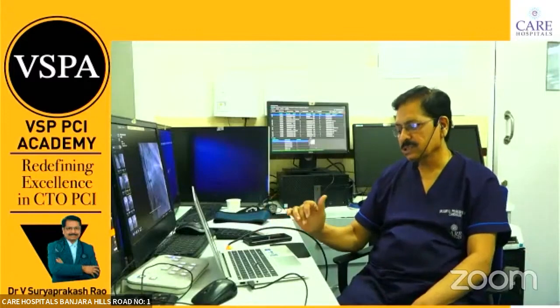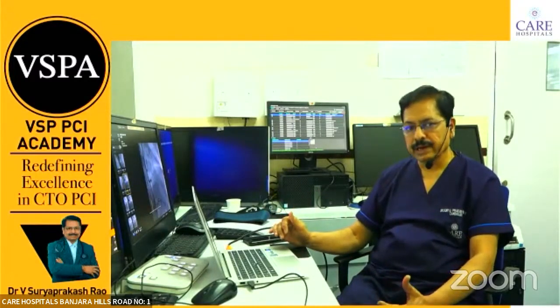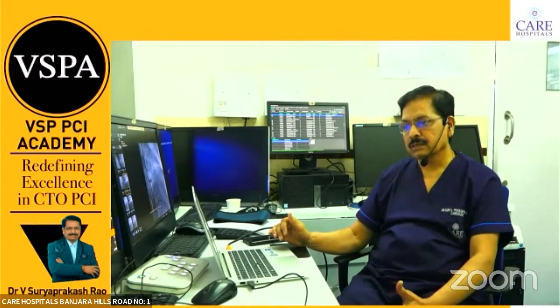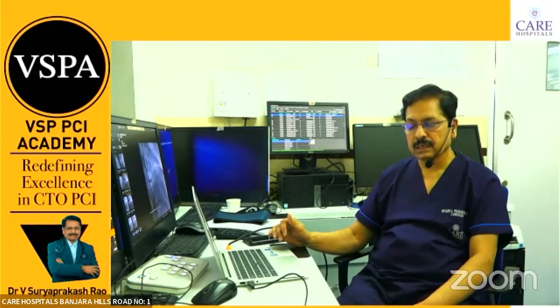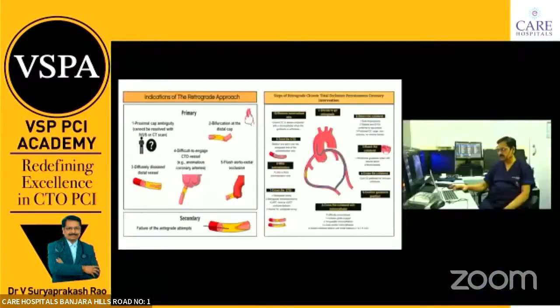Particularly in the RCA, if the CTO ends at a segment with a good-sized PDA or PLV branch, retrograde is always better because of the likelihood of subintimal entry of the antegrade wire and antegrade PCI at the bifurcation. That's why it is important in these cases.